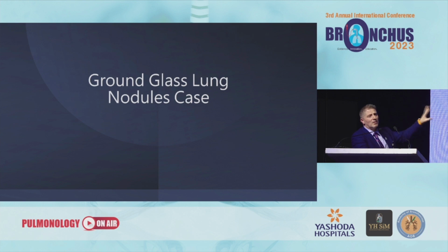And that side is more ground glass, but this case shows one side was squamous cell, the other one came back as adenocarcinoma. And that's the importance of sometimes doing the procedure at the same time for both, where now we feel more confident, especially ruling out the pneumothorax on the spot.